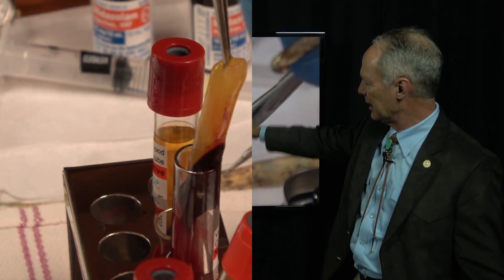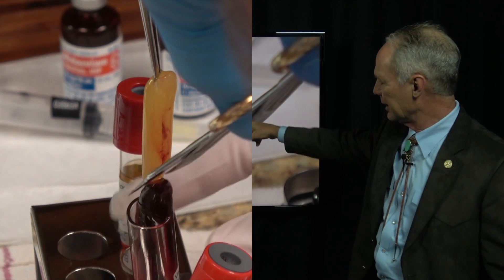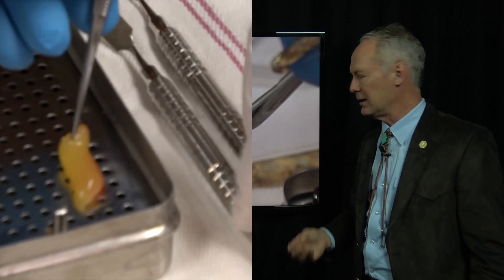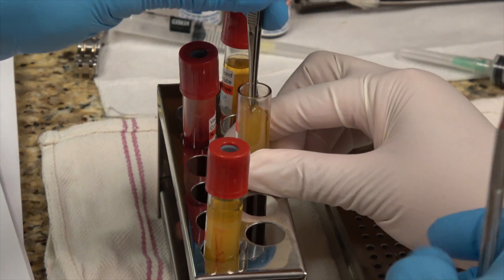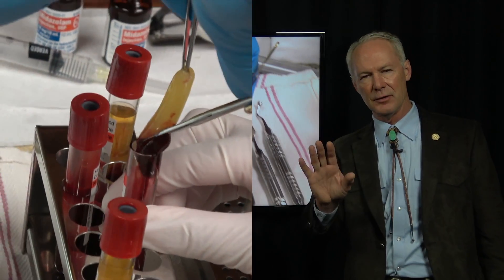The part we're going to use is the yellow part. See, this is the blood clot, and the yellow part is the PRF that's so rich in growth factor and enhances healing. So just cut that off. We're going to put it on a perforated tray.